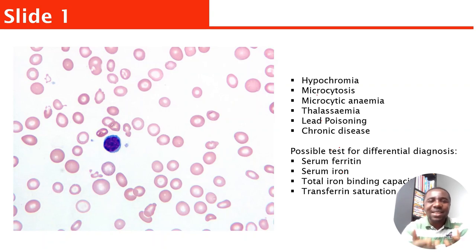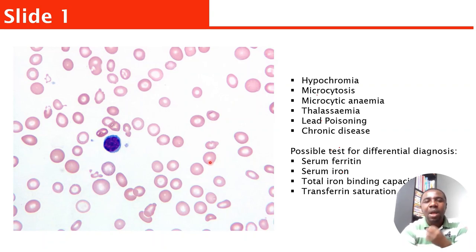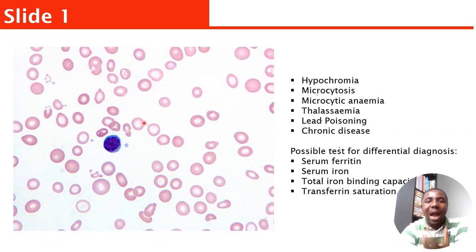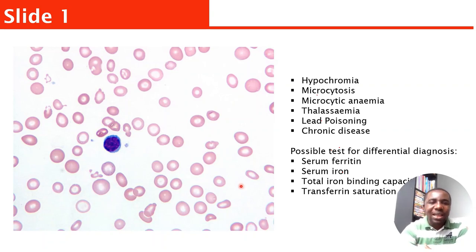Look at this slide. You're going to see there are a lot of cells with different shapes and sizes. The center pallor of the red cells — they are not properly stained. There are different sizes: some are small, some are big, some medium. This is a typical example of microcytic anemia. There is a lot of microcytosis — the red cells are smaller in size. Because of the lack of staining at the center pallor, it's called hypochromia. Different sizes is called anisocytosis, and different shapes is called poikilocytosis.